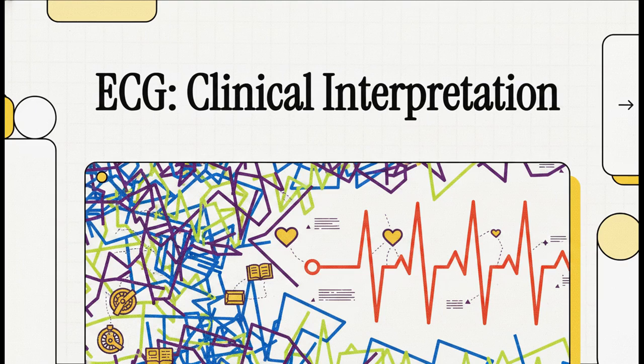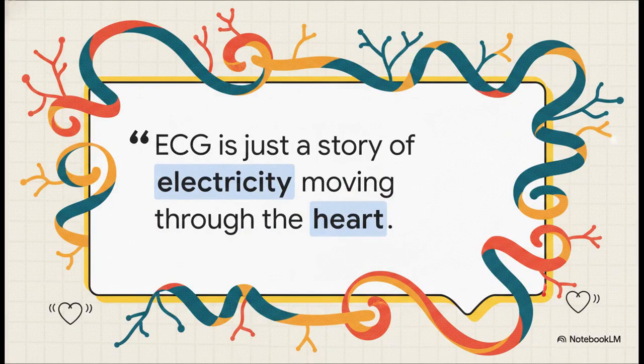All right, let's jump right in. The ECG, I know for a lot of people, it just looks like a bunch of squiggly lines on a page. It can feel like you're trying to crack some kind of complex, intimidating code. But what if I told you that by the end of this, you won't see a code at all? You'll see a story. And really, that's it.